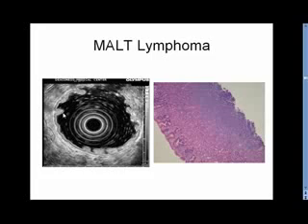This is another case where we have relatively mild thickening of the mucosa and submucosa, but it occupies approximately 50% of the total thickness of the gastric wall, which is also not normal. And the reason for this was the MALT lymphoma, which you can see here. There's a very dense infiltrate of all these blue cells, which are neoplastic monoclonal lymphocytes.